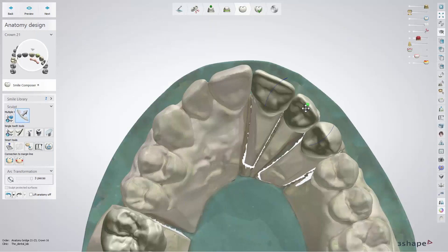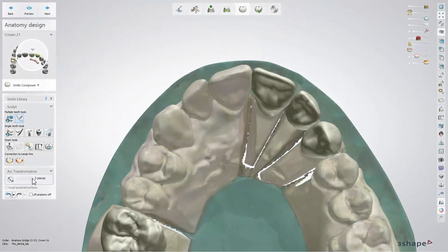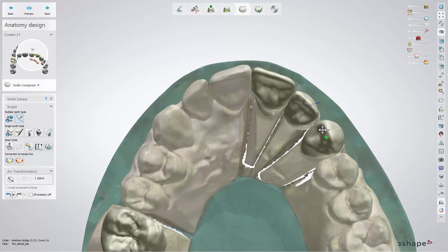The Arc Transformation tool lets you move a restoration composed of more than one tooth into an optimum position. Hover the mouse cursor over a tooth in the multiple restoration and adjust its position while keeping the left mouse button pressed. You can adjust the number of teeth the transformation affects, indicated with the blue circle. The size of the circle can be changed by using a slider or by rotating the mouse wheel while the Control key is pressed.